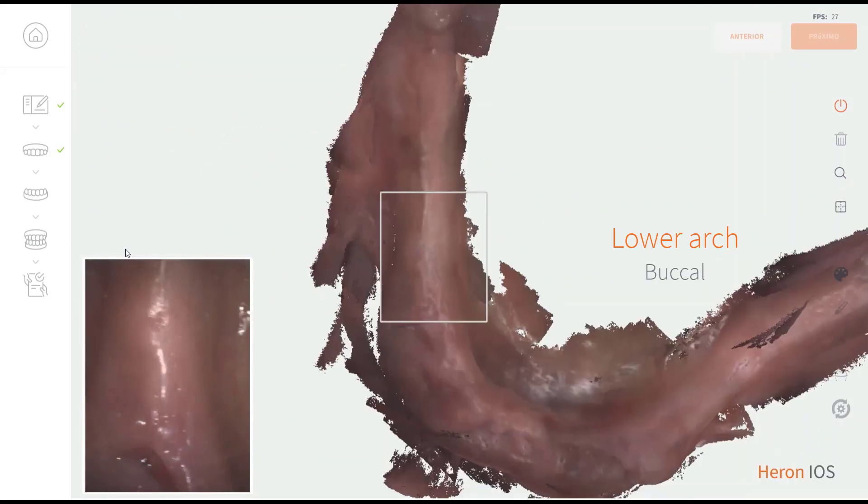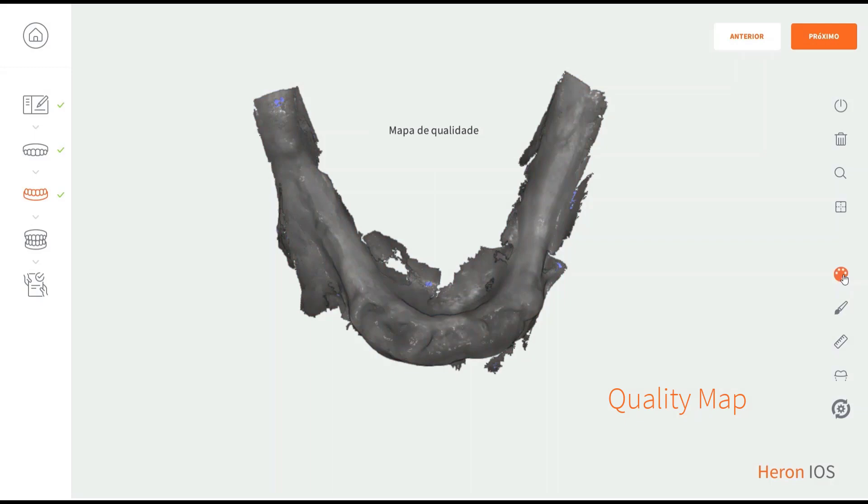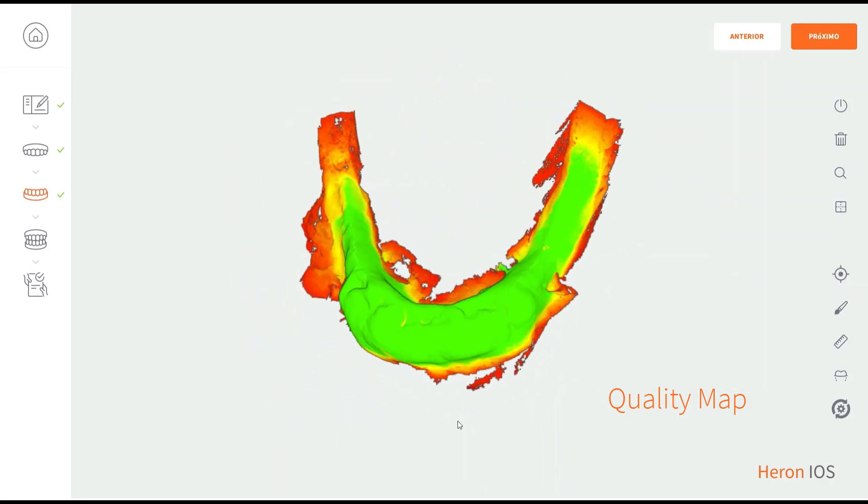Complete your lower scan with the buccal surface. Using the quality map before moving on will help you check the integrity of your scan and spot potential errors in the mesh.